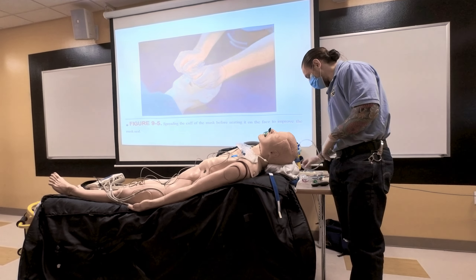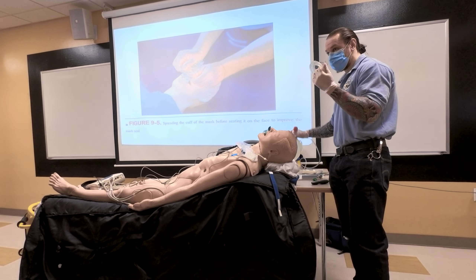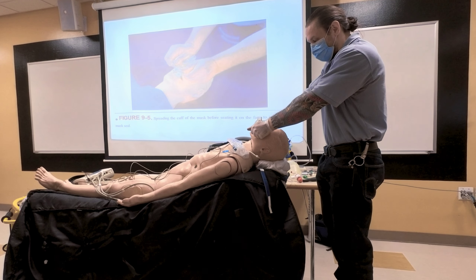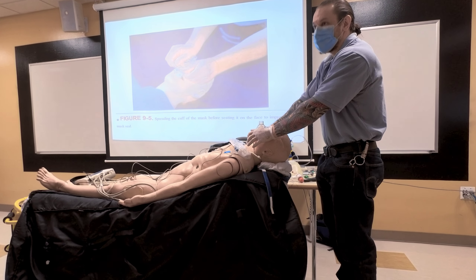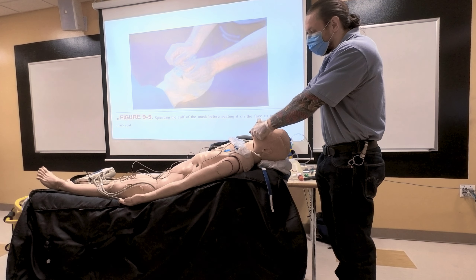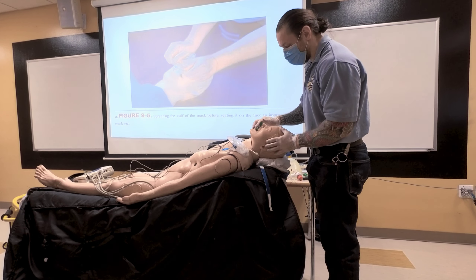You were asking how we're going to BVM. We're definitely going to put all our adjuncts — we're going to measure our OPA, corner of the mouth to the angle of the mandible, use a cross-finger technique to insert. Then we're going to use our nasal trumpet. Usually I put both: you put a lubricant, bevel to the septum, go straight down. Two nasal trumpets and an oropharyngeal airway.